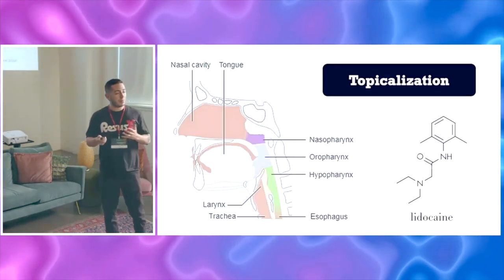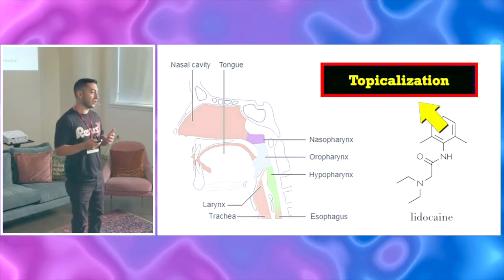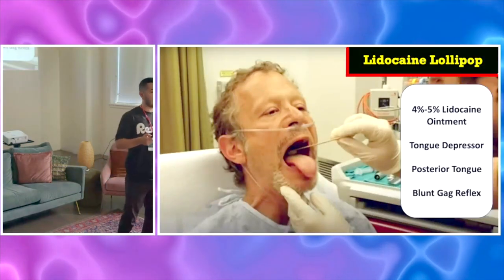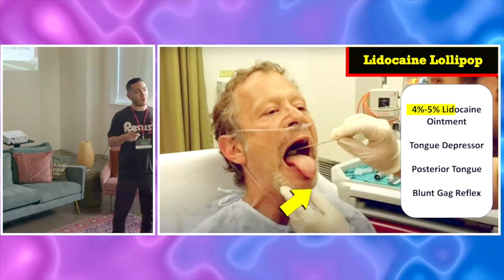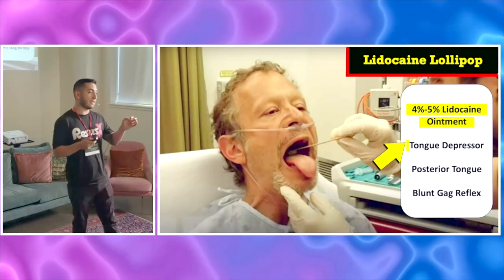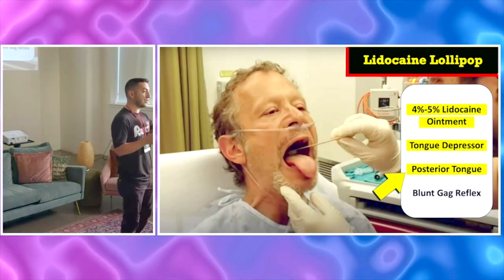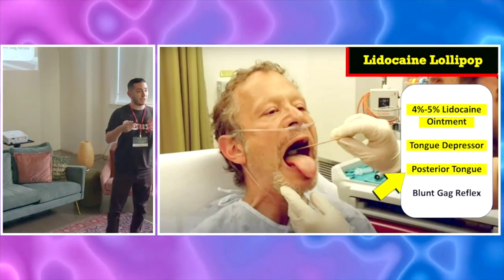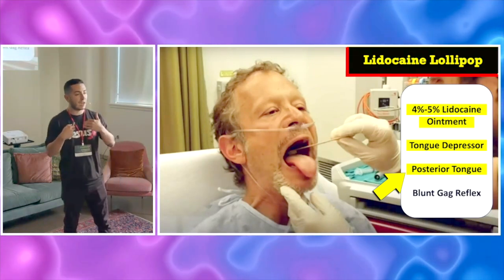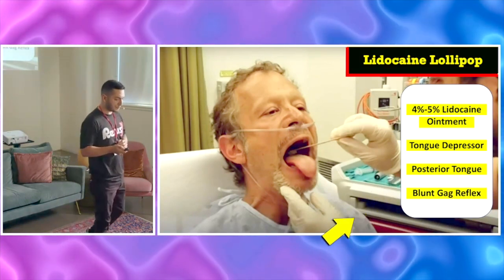The next step, and probably the most important, is topicalization, right? If you do this well, the procedure should go very smoothly. The first thing you want to do is your lidocaine lollipop. So here you're going to use 4 or 5% lidocaine ointment or jelly, and you're going to put a small amount at the end of a tongue depressor. And you're going to take that tongue depressor and put it over the posterior tongue. The moisture of the oropharynx is going to melt the ointment and cause the lidocaine to seep down into the posterior tongue and into that hypopharynx, blunting the gag reflex and topicalizing all of those areas.